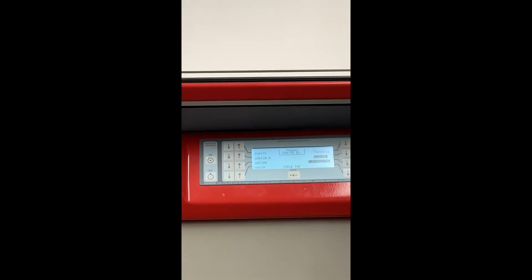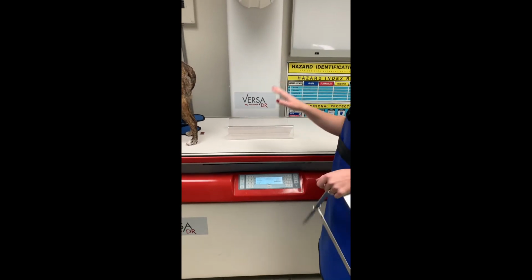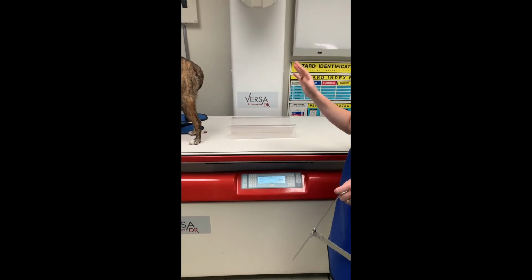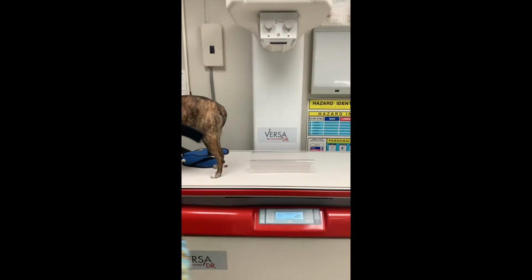This time we're going to be using a trough, and I won't really need an assistant for the behind end to do anything, so she'll just be holding her steady in the trough to make sure she's not going one way or the other.